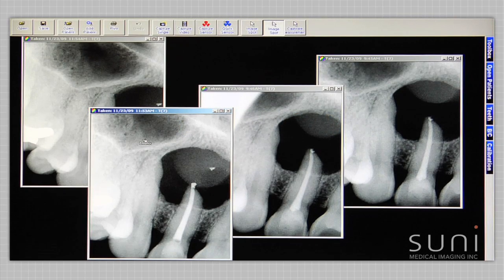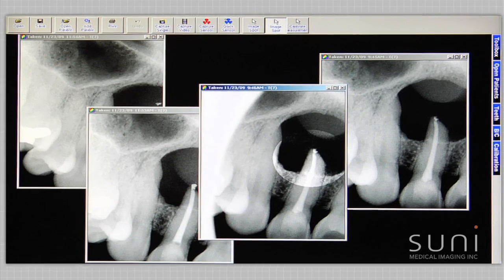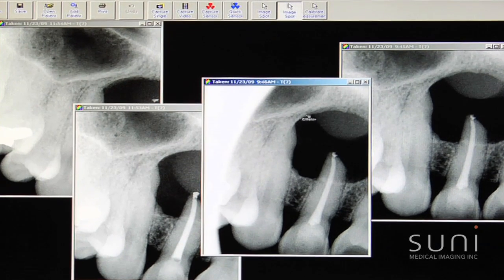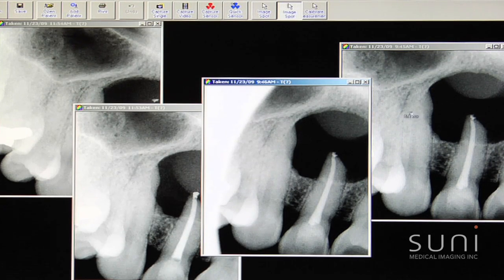Our second case is a young lady that presents with no pain and previous root canal treatment. This was the initial root canal treatment and a very large periapical radiolucency, which initially appears to be a cyst, but we can't make that diagnosis radiographically.